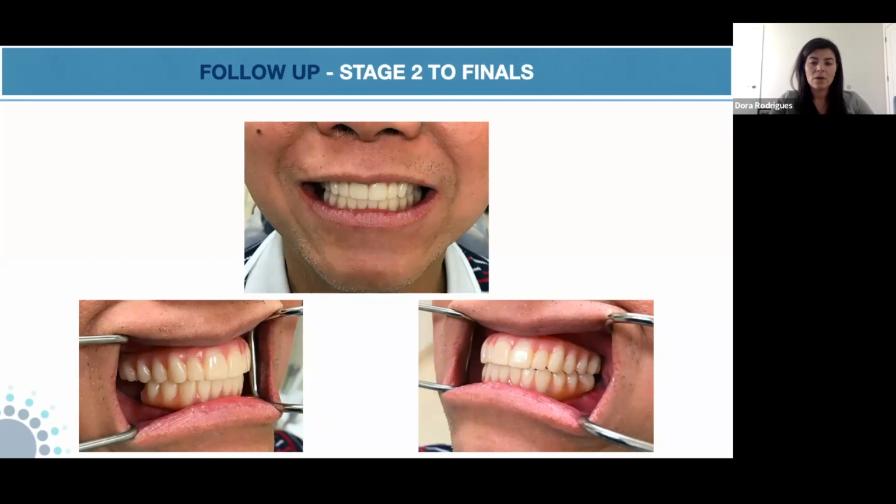The last tooth, sometimes they're not very diligent with, again, the food, or we have to make sure that we don't leave extra space, extra cantilever forces in there. Probably I should have cut a little bit more of the tooth that I left there. But the Flexera, this is just 6 months after, I believe, and the material still looks very, very nice in the mouth.